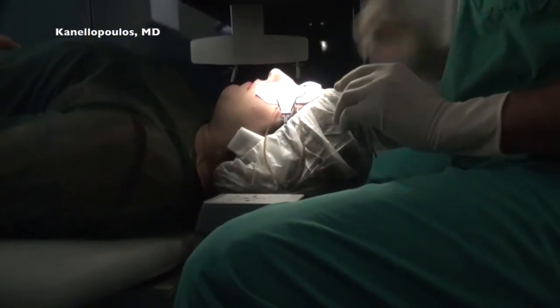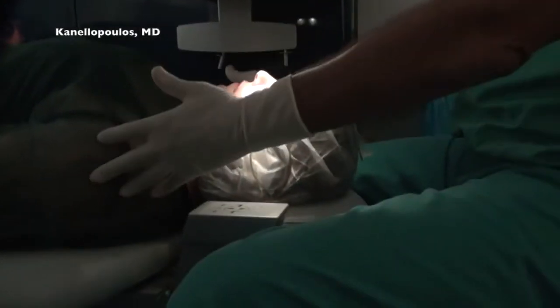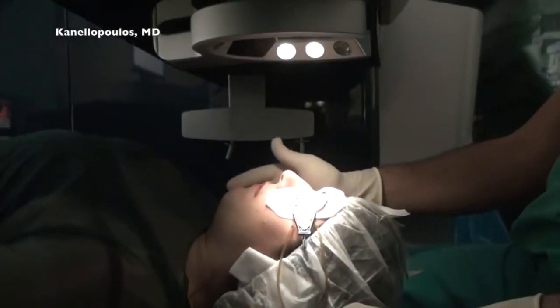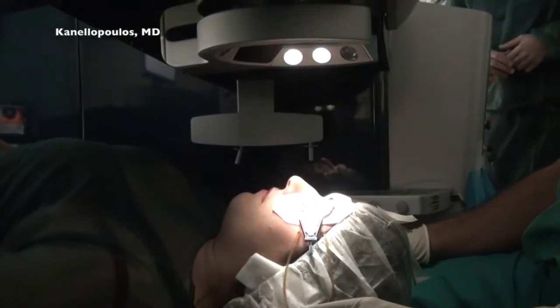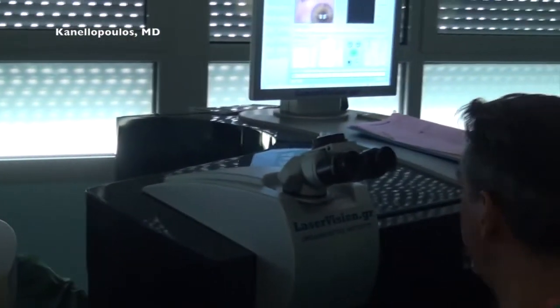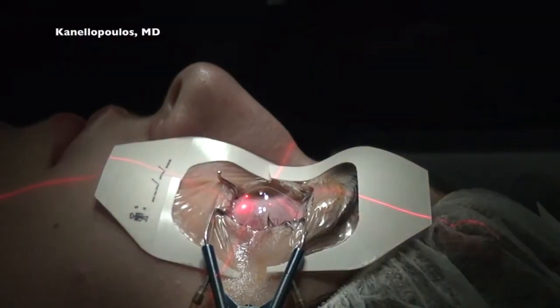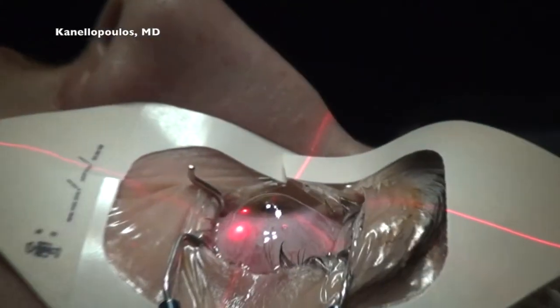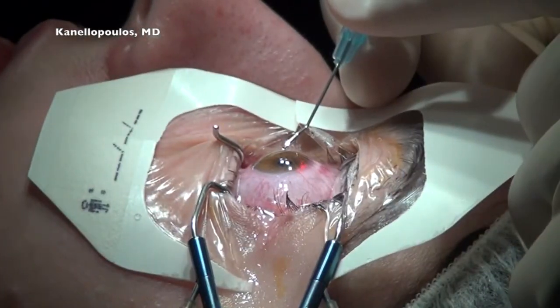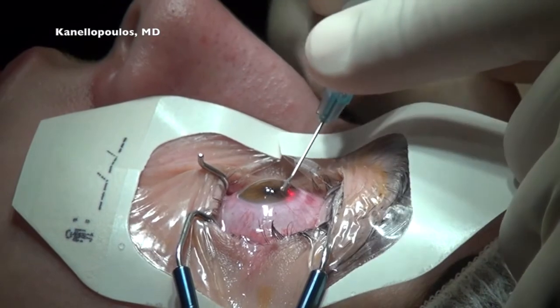So we're going to see the same procedure in the left eye from a side view here, and I really like this take because it's very important for the beginning surgeon to see how we line up the patient. Everything has to be orthogonal. Patients tend to tilt their head sometimes, so we want shoulders and neck to be in orthogonal angles. And the laser has these crosshair red lights that help you orient the cheekbones, the forehead, and the shoulders of the patient.